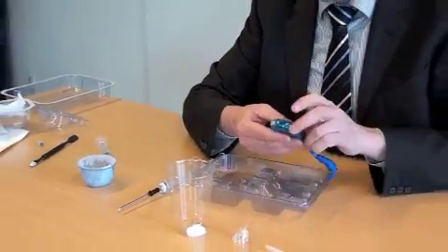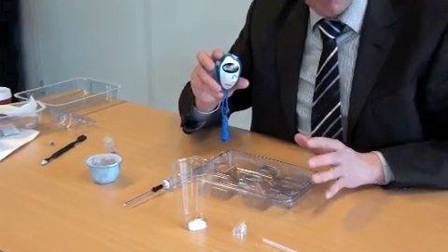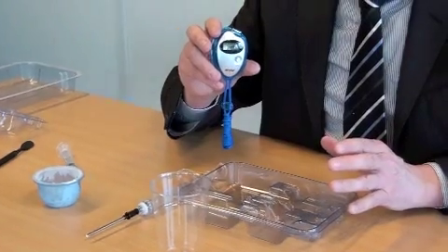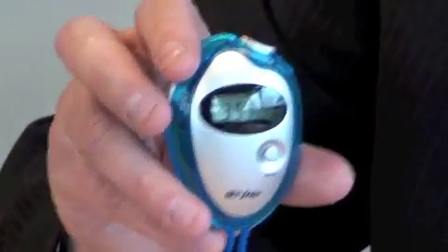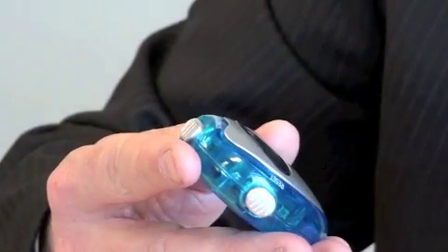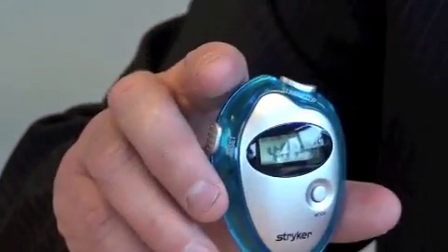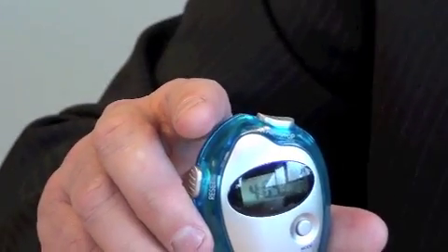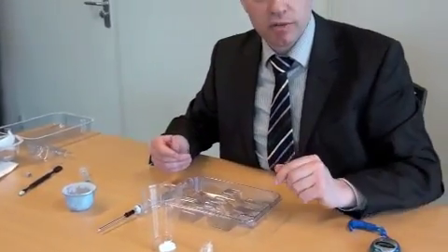So looking at the time, it is now 3 minutes and 43 seconds, and normally you have up to 4 minutes and 30 seconds to have this done. So actually I'm way in time, and normally everything should be easy to do within this time frame. After 4.5 minutes, surgeons should stop manipulating any Hydroset and just let it be and let it get hard. So this was the preparation of Hydroset, assuming that we were loading a 10cc sample.